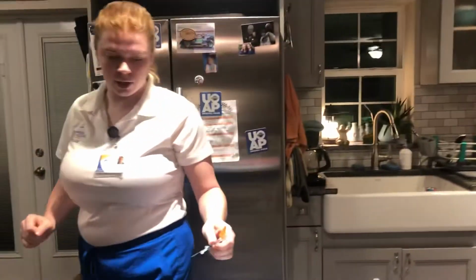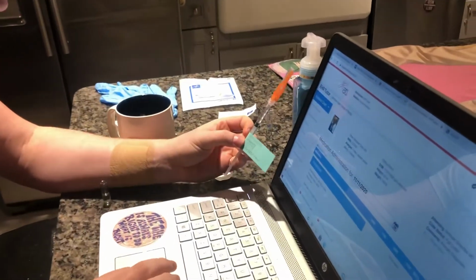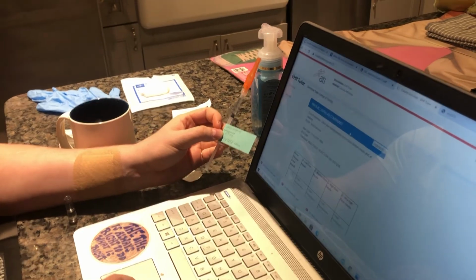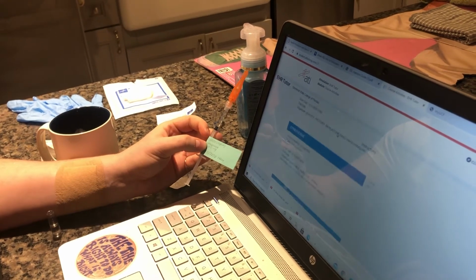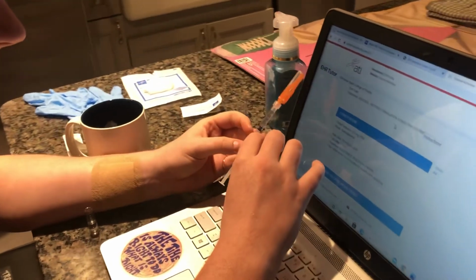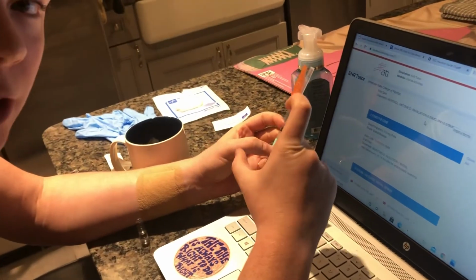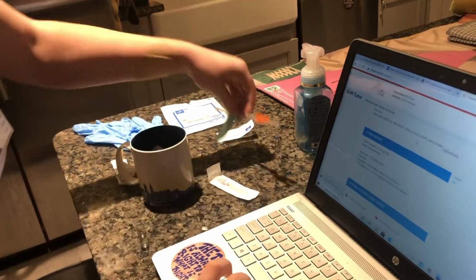So I'm going to grab my labeled syringe. We do Oscar Simpson, down to epinephrine. So it's going to be 0.5 milligrams as needed. The route is subcutaneous, and the time we are giving it is now. In my second check too, I'd want to compare this also to the original med sheet along with this right here. So we have that done. After I did my third check, I'm going to go ahead and put on some gloves.